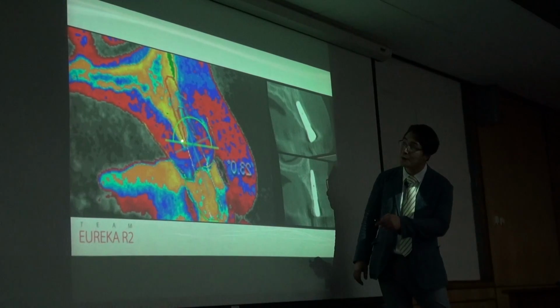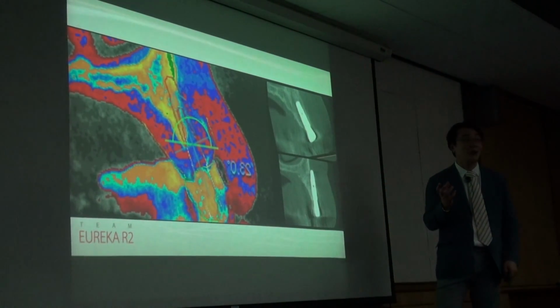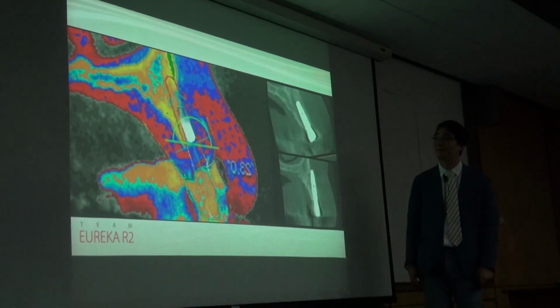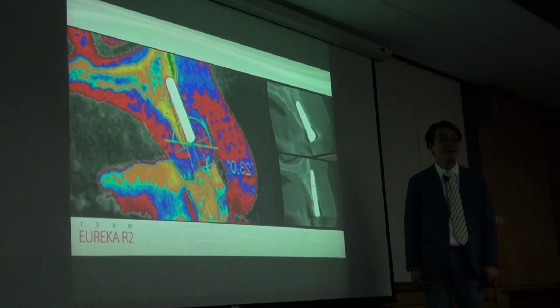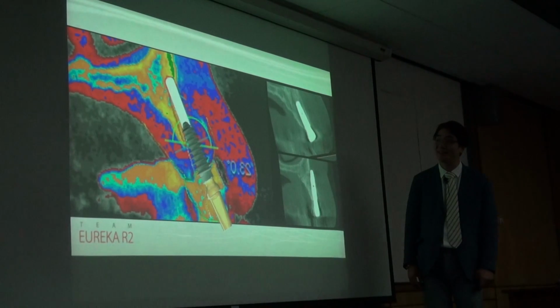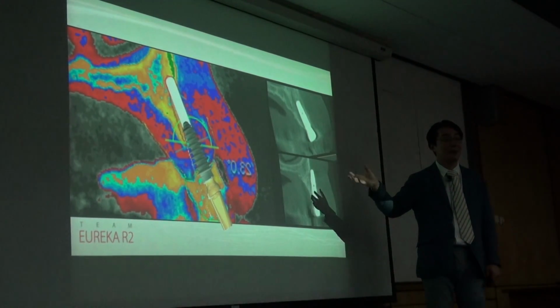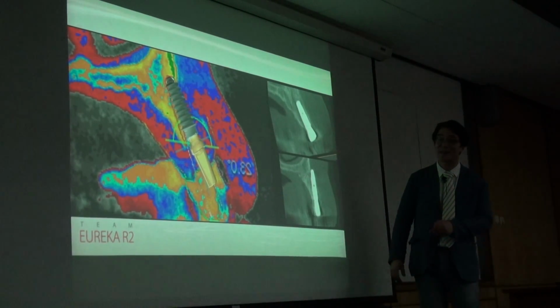This palatal bone hardness is very hard, right? But in the extraction socket side, many clinicians think like this. After preparing the small size of the bone in the apex only, after that, using a guide, and it has a very high ability of self-tapping, if I place the implant, it will place like this.